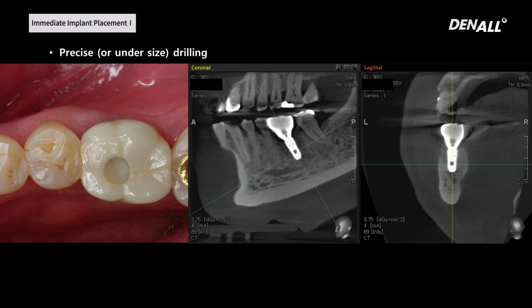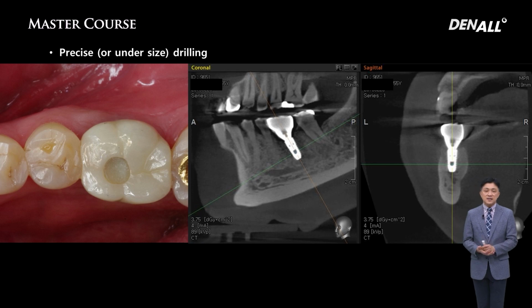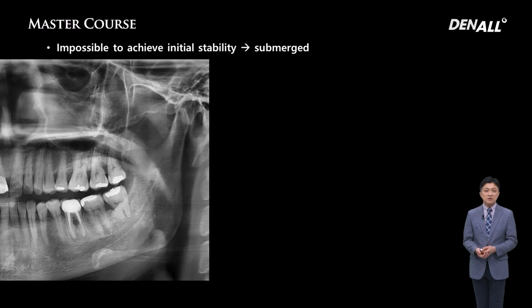On CT, as you can see, buccal bone has been regenerated. It's quite favorable. I'm continuing to follow up with this patient, and the patient is not experiencing any complications. As shown, it is very important to drill in accurate position and accurate depths. And to do this, initial drilling is very important.